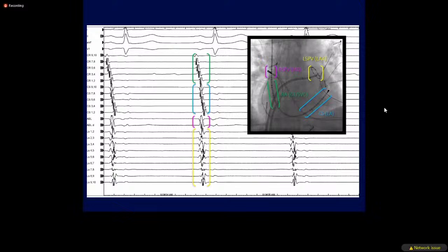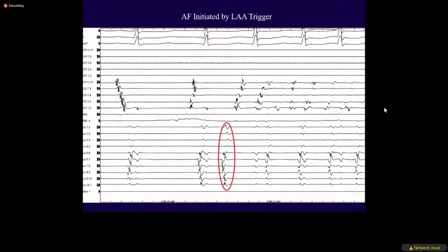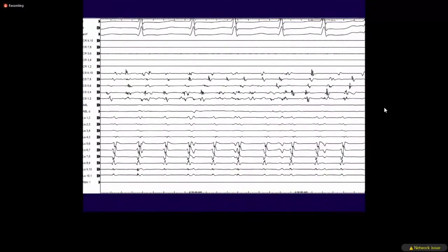This is the catheter position. And on isoproterenol, we see this. So the lasso is early, right? And then, as I showed before, whatever happened after firing started is irrelevant because this patient then eventually goes into AFib.